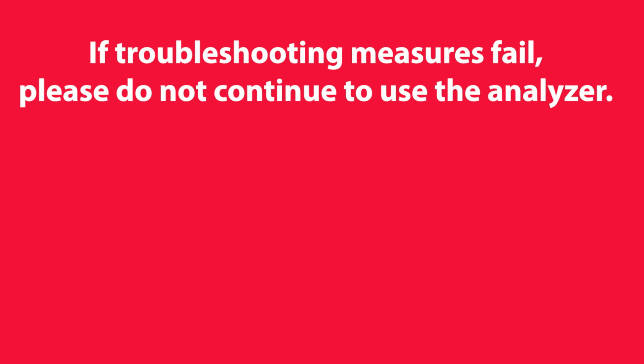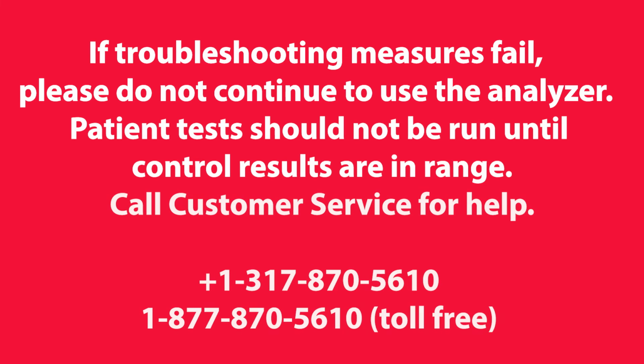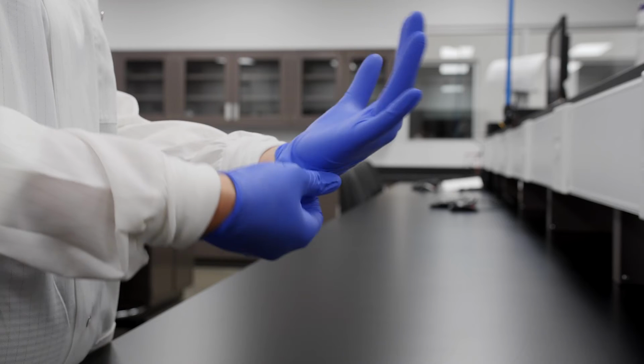If troubleshooting measures fail, please do not continue to use the analyzer. Patient tests should not be run until control results are in range. Call customer service for help. Once you've verified that your analyzer is working properly by running a check strip and controls, you're ready to run a patient test. Put on a new pair of disposable gloves.